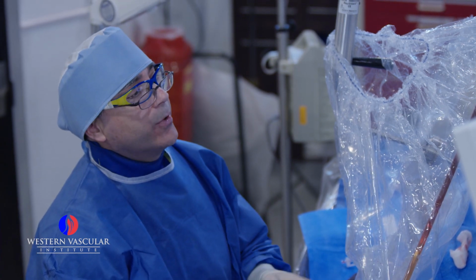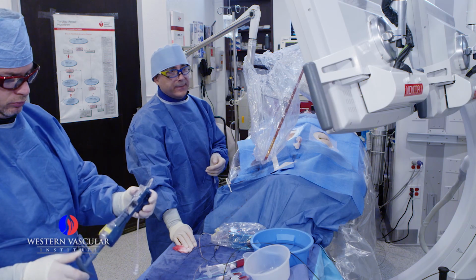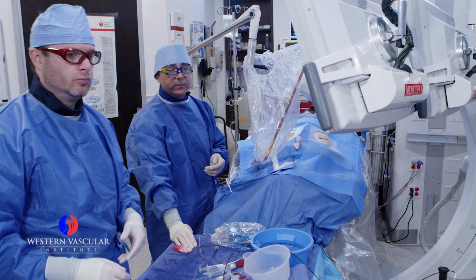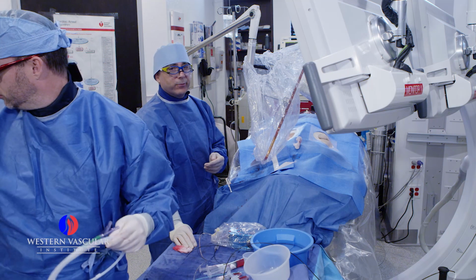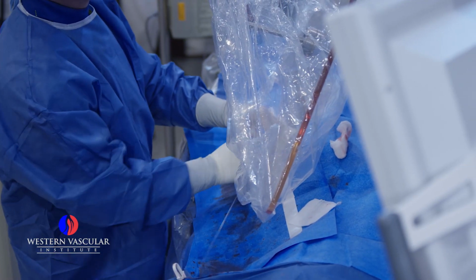And we always touch up an artery, make it look pretty, if you will, after atherectomy with a balloon. The results of the two combined tend to be better than either one of them alone. So we almost always do both in a patient at the same time, with rare exception. So now we're going to dilate the artery with a balloon.